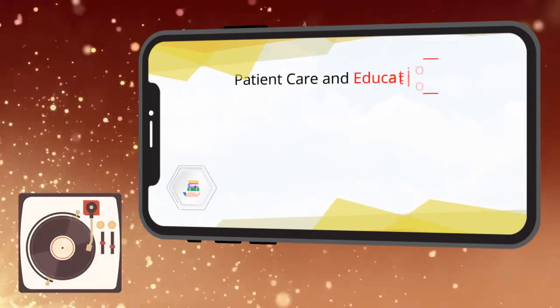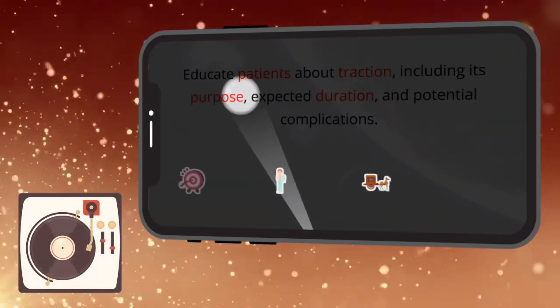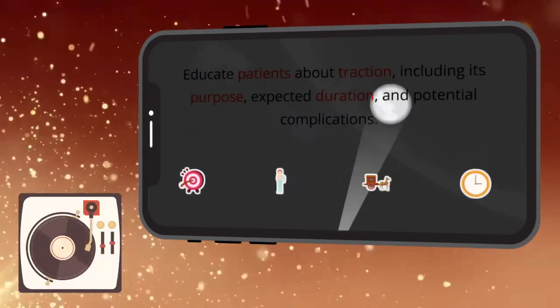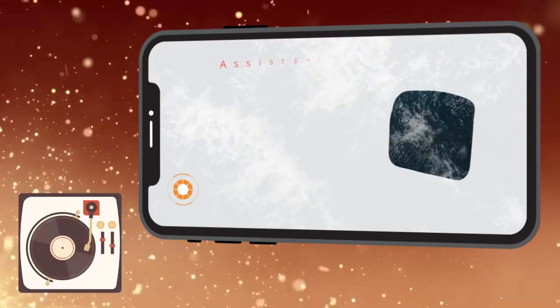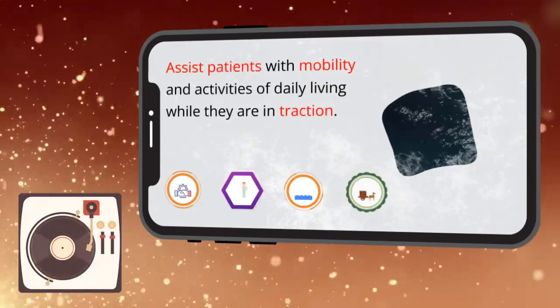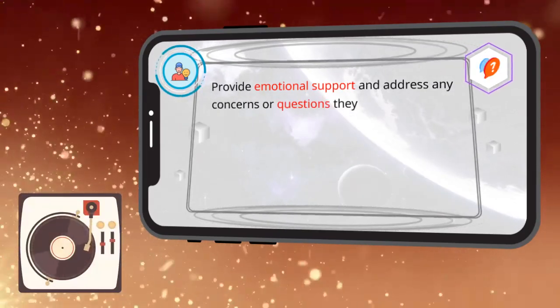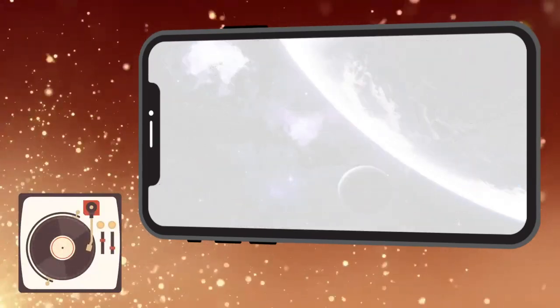Patient care and education. Educate patients about traction, including its purpose, expected duration, and potential complications. Assist patients with mobility and activities of daily living while they are in traction. Provide emotional support and address any concerns or questions they may have about the traction treatment.